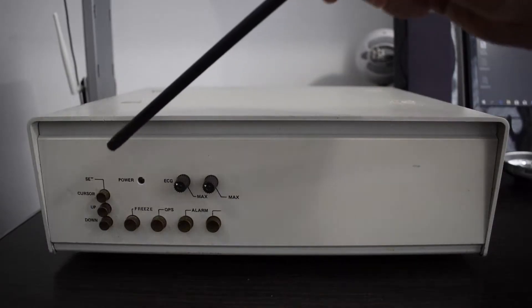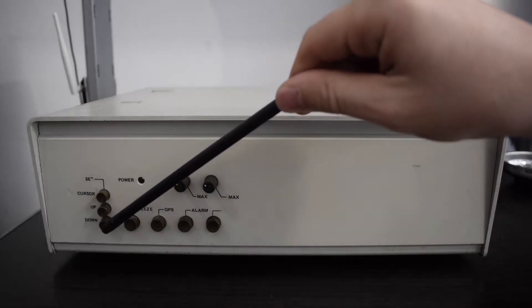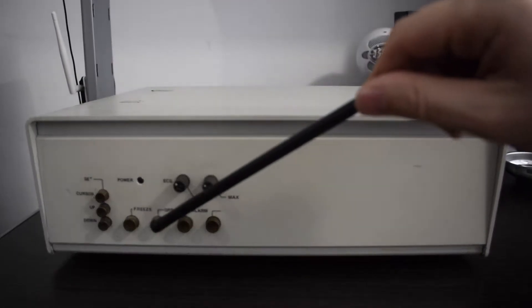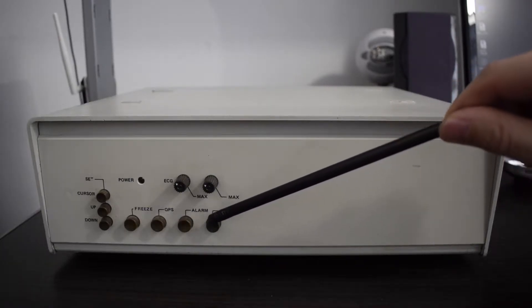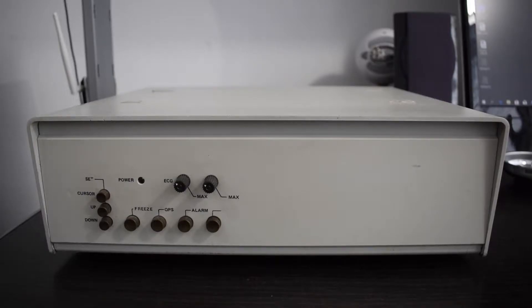On the buttons topic: a set cursor button here, right below it up and down buttons, and next to them a freeze button and a QRS button — that's some ECG specific stuff — and next to the QRS button, alarm buttons, you will be able to hear them later. And right above all those buttons, two knobs and a power LED.